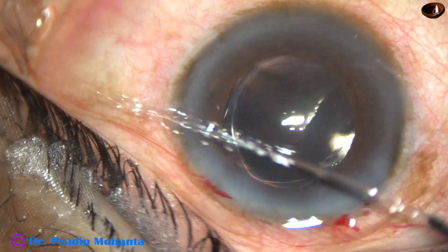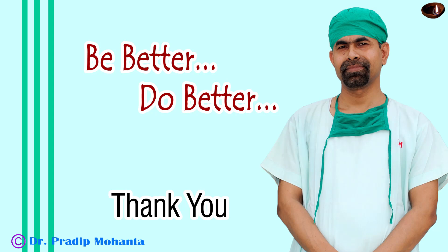Thank you very much for your attention. I hope this video will help you in learning mechanical chop. Don't use vacuum. Dig a pit just in front of the main incision. Support the lens mass in front by the phaco needle, and use your chopper to divide the nucleus into two heminuclei. Thank you very much for your attention.